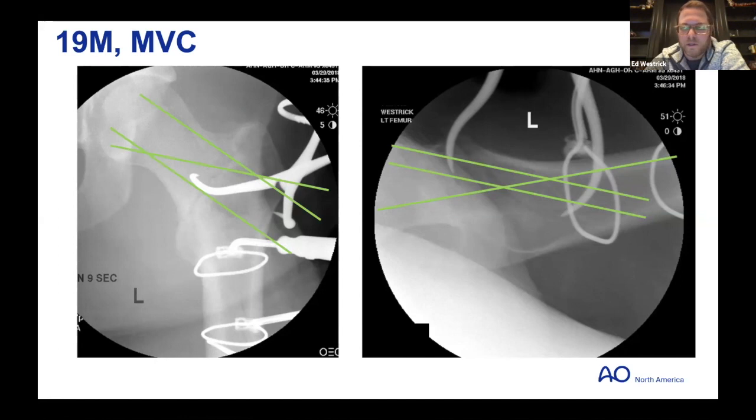Because you do a lot of revision arthroplasty, is it the same type of tension you're putting on it, or is this just to gather the fragments in? Well, I'm not good enough to use the cable to actually get a reduction, so that's why you see I have pointed clamps everywhere. And then once I have it, I can get the cable on there, and it's holding things in place. For an arthroplasty case, I won't tension them until the final implants are in.